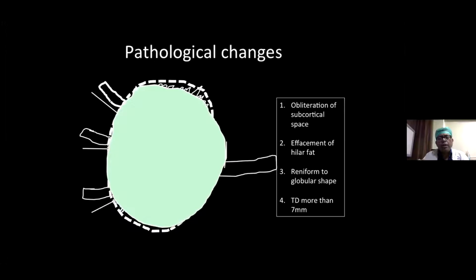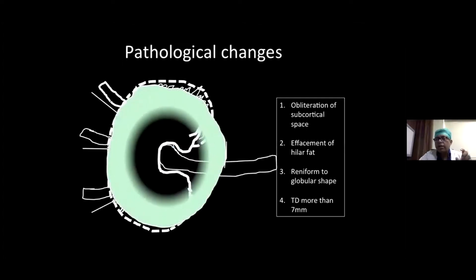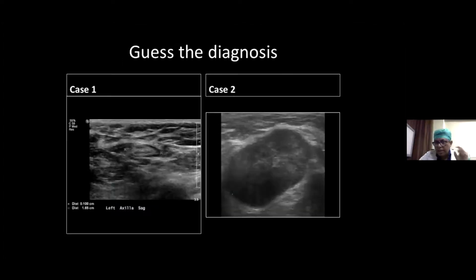So you need to understand that you have to locate a cortical thickening, looking very carefully at the lymph node to understand that this is an early metastasis. So this is not a Birads 3 per se, but I have put it because this is one gray zone which trainees need to train their eyes to understand the early metastasis in an axillary lymph node.